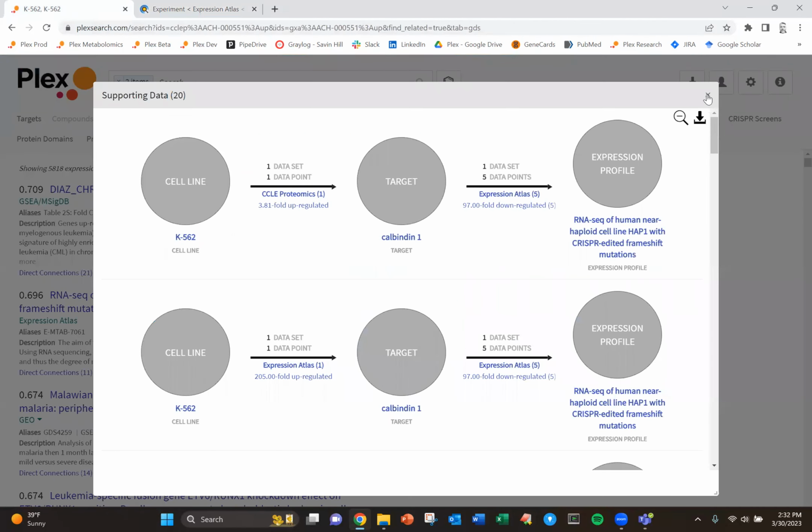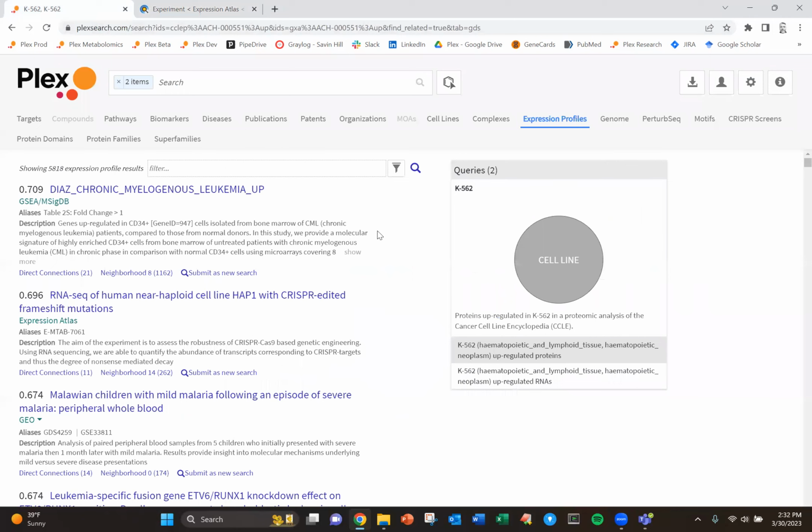So it seems like the genes here are clearly, not surprisingly, associated with CML, apparently also with various modulations of chromatin genes, and other things too. And you can see sort of at the bottom, some other leukemia links. So there could be some interesting things that come up here that might be unexpected. And we can make those kinds of unexpected connections to different biology.